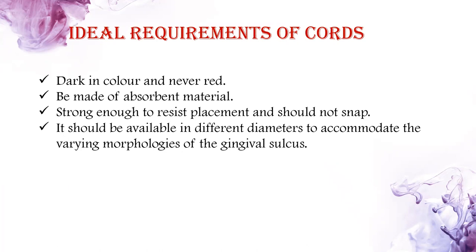Be made of absorbent material, strong enough to resist placement and should not snap. It should be available in different diameters to accommodate the varying morphologies of the gingival sulcus.